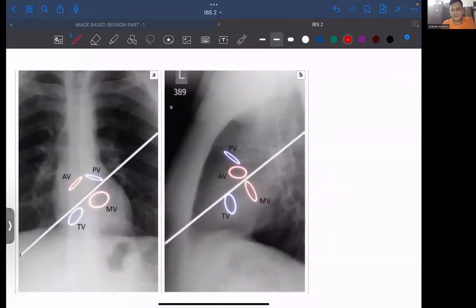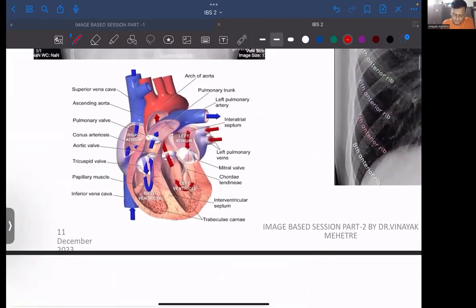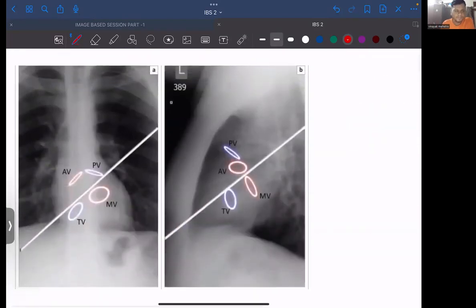Now comes the question on, what is this first? Anyone? The ring which we will put in the valves. These are valve rings, right? छल्ले दले सुना है? छल्ले दले है ना? छल्ले यही होते हैं. Okay. Now, if you have taken a look on normal anatomical valves, right? They are same. They are same. Just you have to take a look properly.